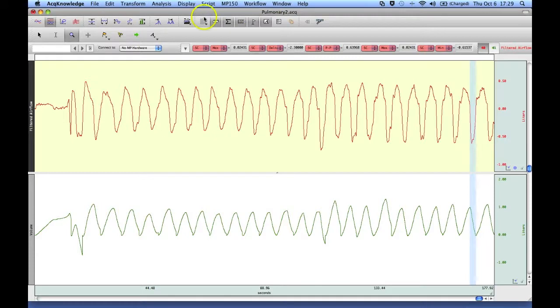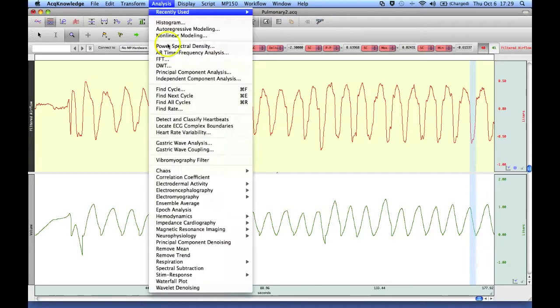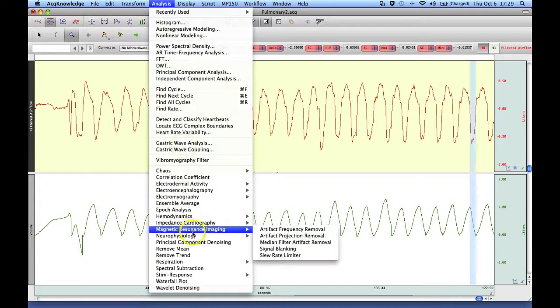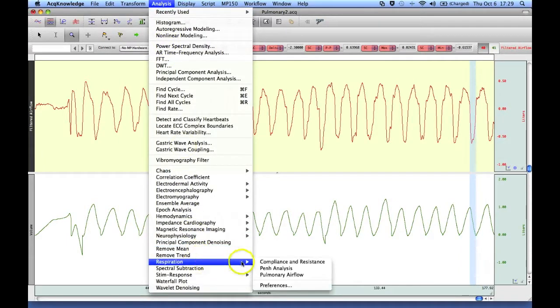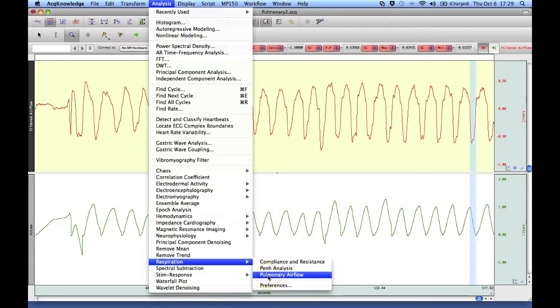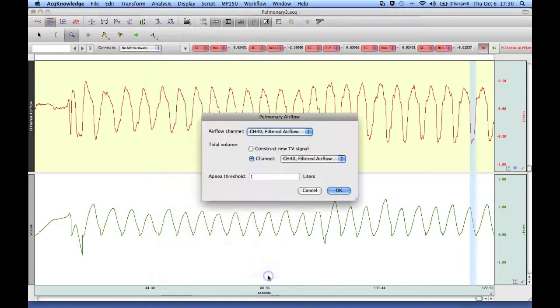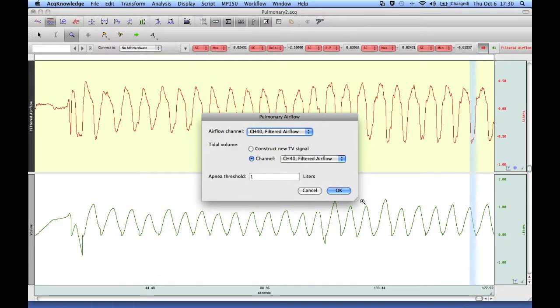So to actually run the analysis routine you have to go to the analysis menu, to the respiration submenu and select pulmonary airflow. This opens up a dialog box that allows you to assign the various channels.